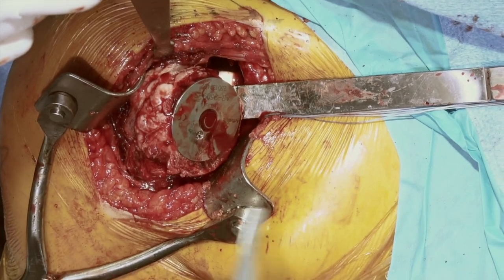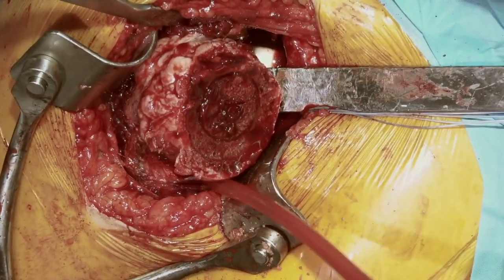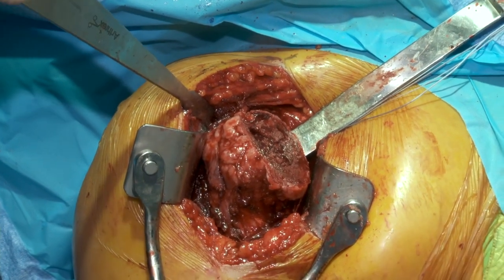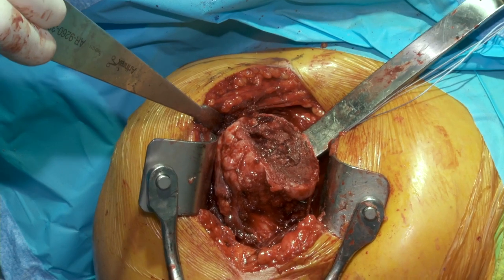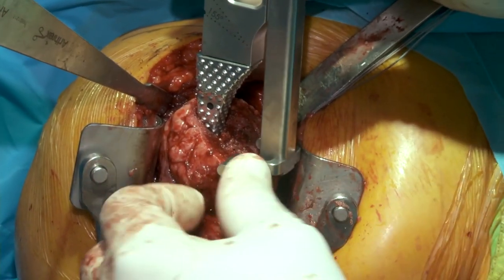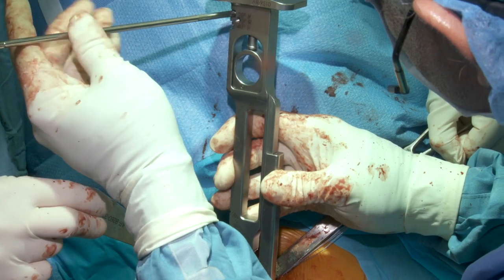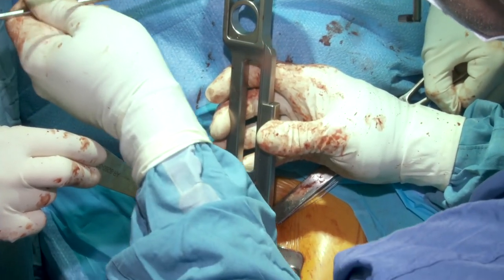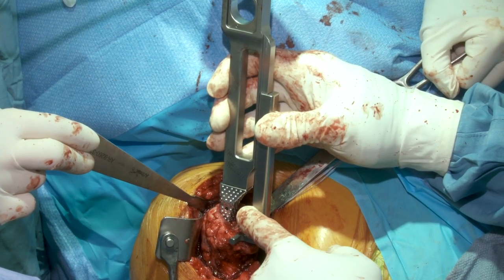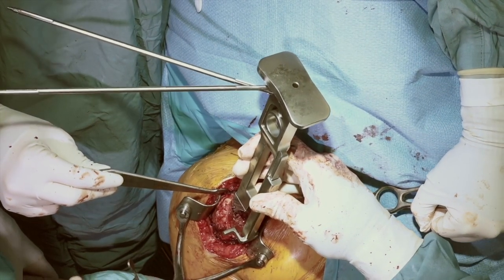We'll take our elevator and elevate off our humeral head cut protector and begin to prepare our humeral side. We had the size 6 reamer in place and we're not going to go any larger, so we'll start with our size 6 broach and then our version rods. Our outrigger slides onto our implant and helps hold us to our cut surface, but we can also check with our version rods — one at 20 degrees and one at 40 degrees — and our forearm should sit right in between. We have the cut surface to check as well as the version rods, and we can tell the forearm is sitting right in between the two, helping us identify the best position.